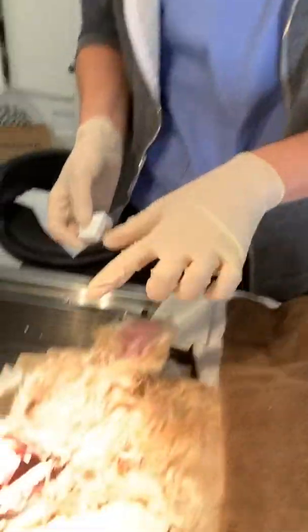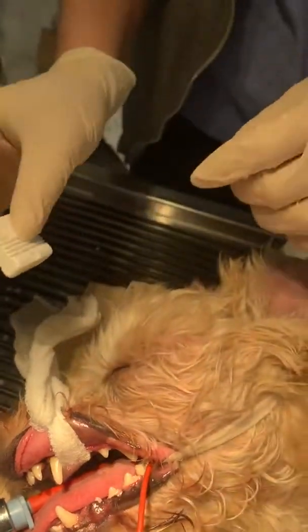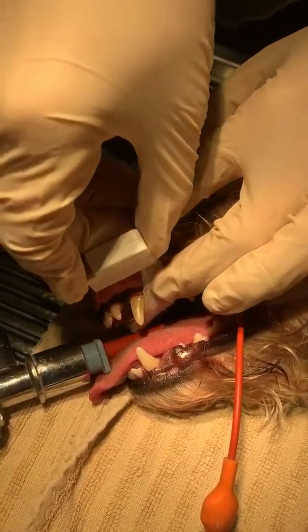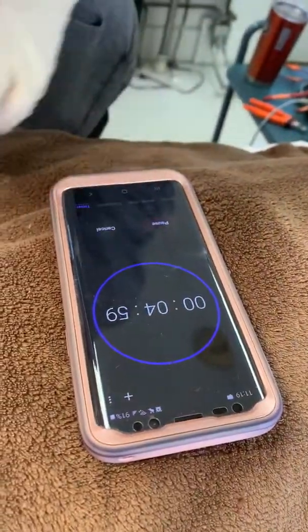I'm going to do a buccal mucosal bleed time test here. You'll see I already have the lip tied back with some roll gauze just to hold it in place. I'm going to use the lancet here — I'll talk through it as I do it — and line up that little incision spot right over the gum. Press. And then I have my timer started over here on the side for five minutes.